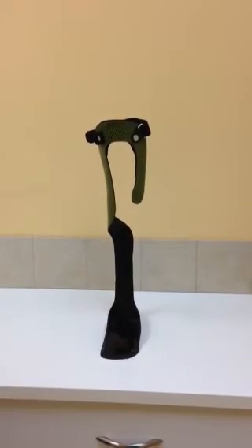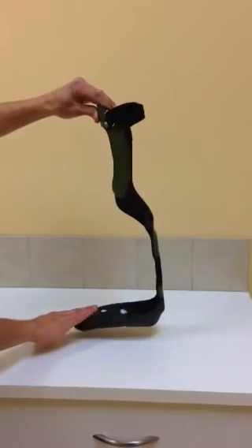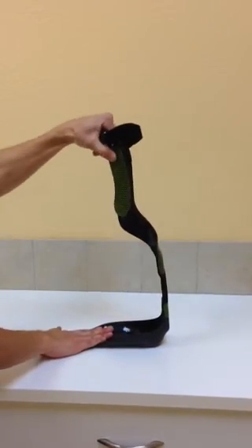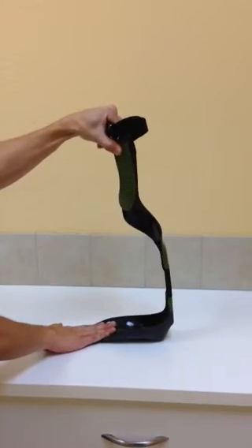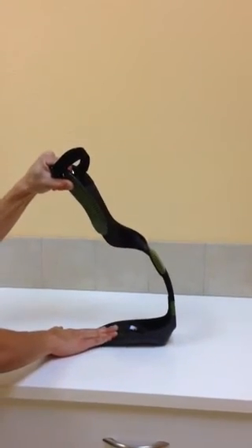And now we'll have a demonstration of how much this brace flexes. And there, as you can see, the amount of compression put into this brace — and the brace holds that compression quite well.